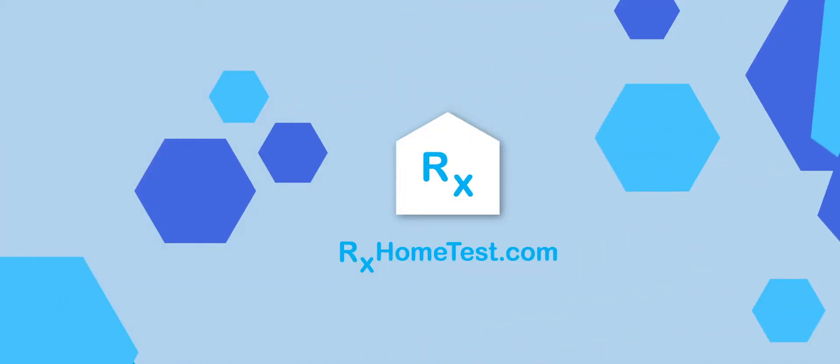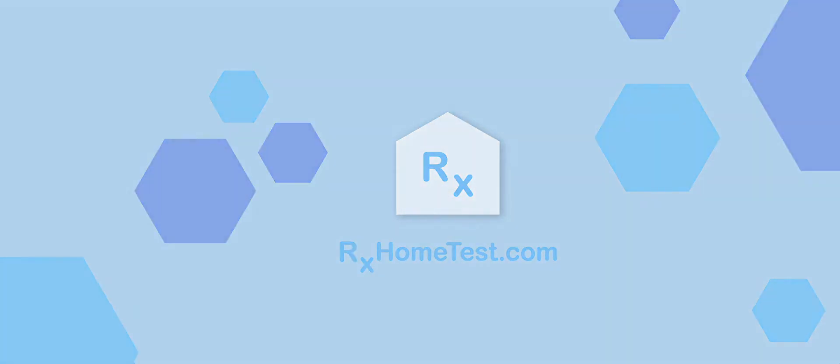Welcome to the instructional video on how to collect your blood sample using the dry blood spot test by RX Home Test.